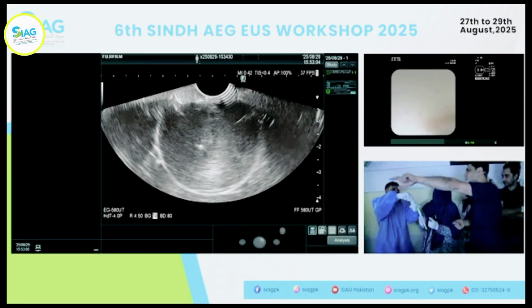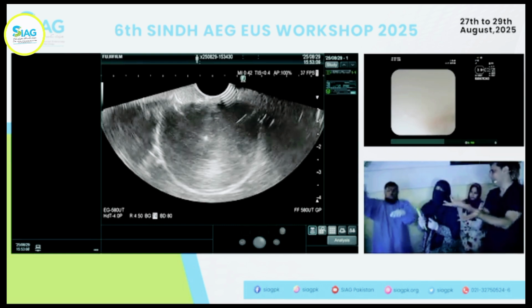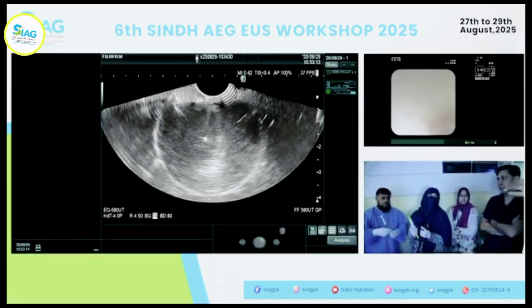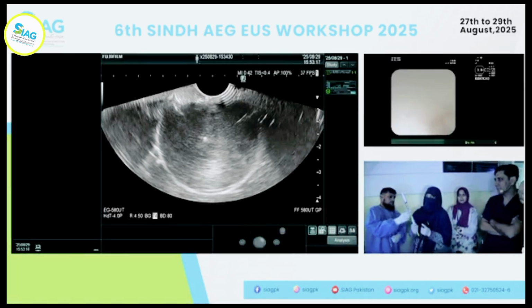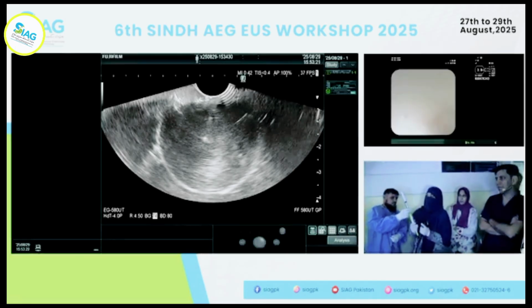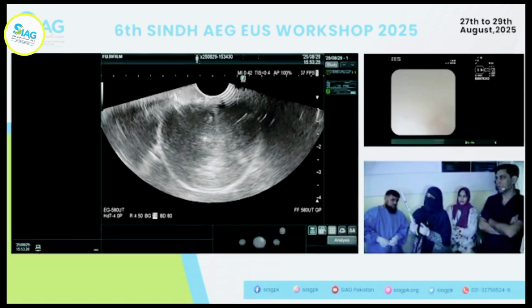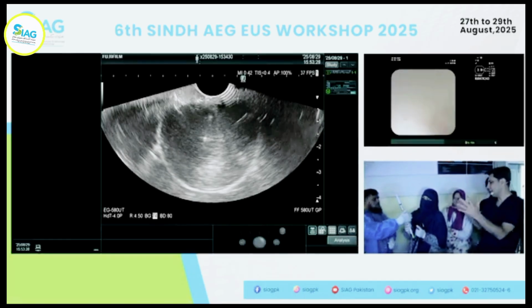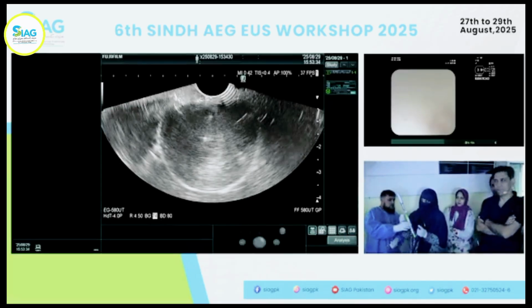As the doctor taught, you have to go right at the tip of the lesion, because in the center of a mass there will be necrosis, and you'll get nothing. In a cyst it's fine, you've come to the middle. In fact, in a cyst I personally prefer the middle, because when the wire is coming out, if you're too close, the wire will make an angle and the sheath as well. So I keep it in the middle. But for a mass, you need to go to the end. Another reason is if the cyst is going to collapse, you want to stay right in the center of it. Good.